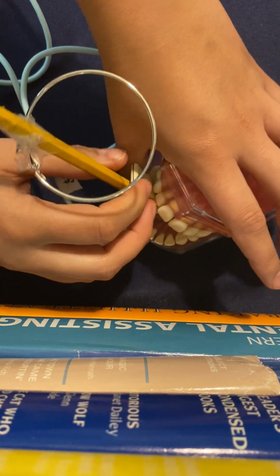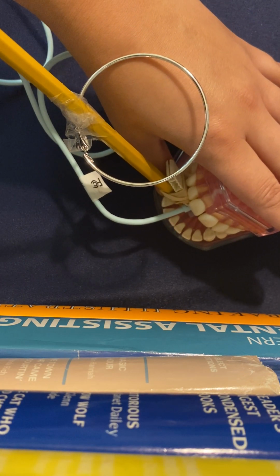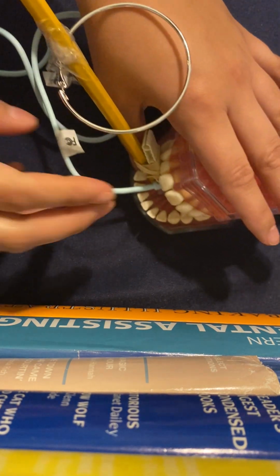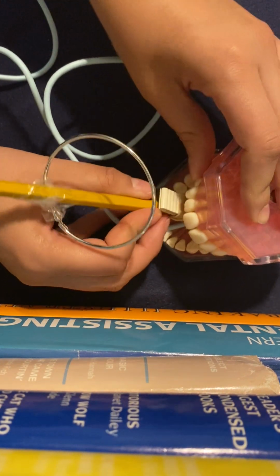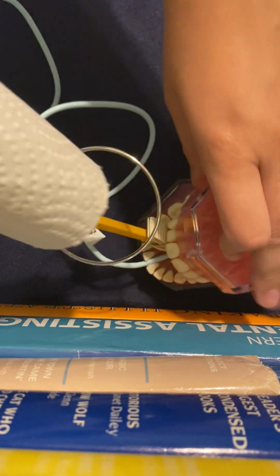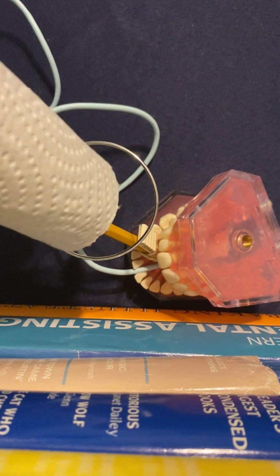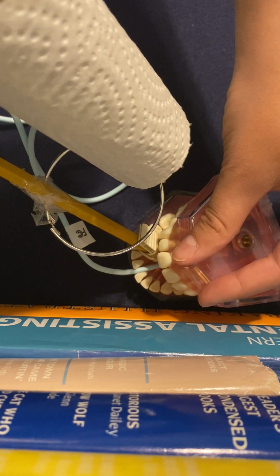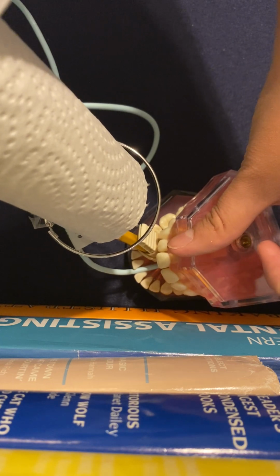So for the receptor placement, you're going to want to center with the lateral canine contact point. The teeth you're going to want to see are the mesial and the apex of the canine, mesial, distal, and apex of the lateral incisor. So you're going to want him to bite down on that. There's that canine. So I'll do this one-handed, and you're going to want to point, because pretend this is the nose, and this is kind of around the cheeky area. So you're going to want to point from the corner of the nose. Pretend this is a nose, so this little corner right here, you're going to want to point and line that up with the corner of the nose.